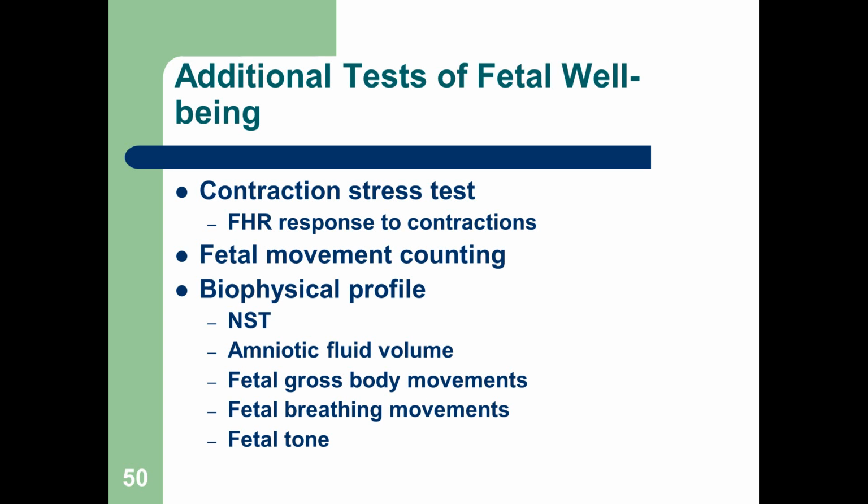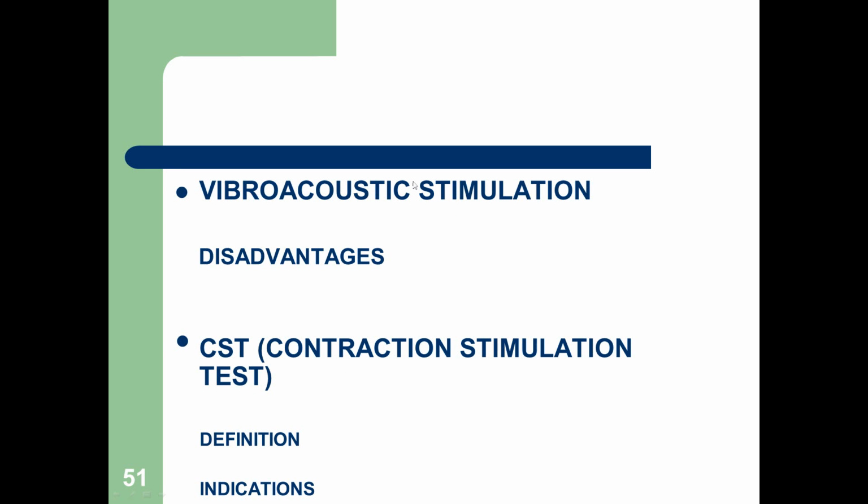Additional tests: a contraction stress test, and that's the fetus's response to contractions. You have fetal movement counting. You have the biophysical profile. Vibroacoustic stimulation, I'm going to just let you read that in your book. It's not used very often, and I'll be honest, I've not seen that used around here.